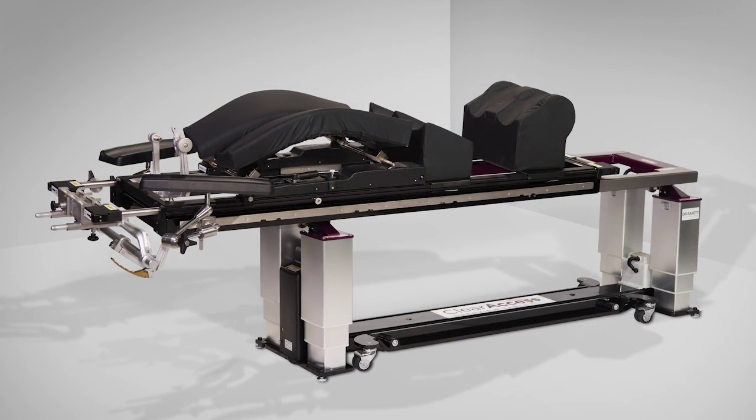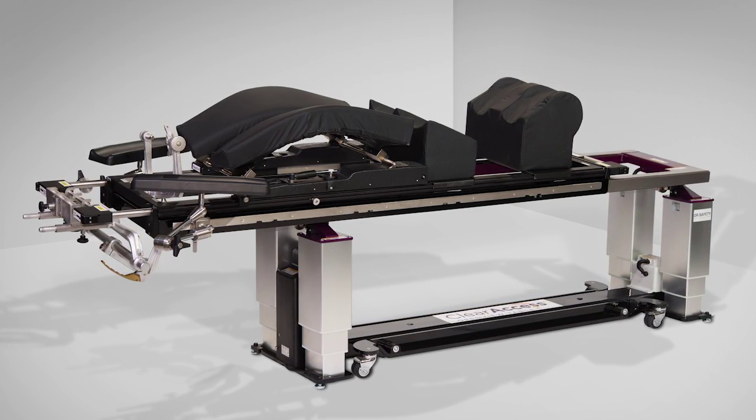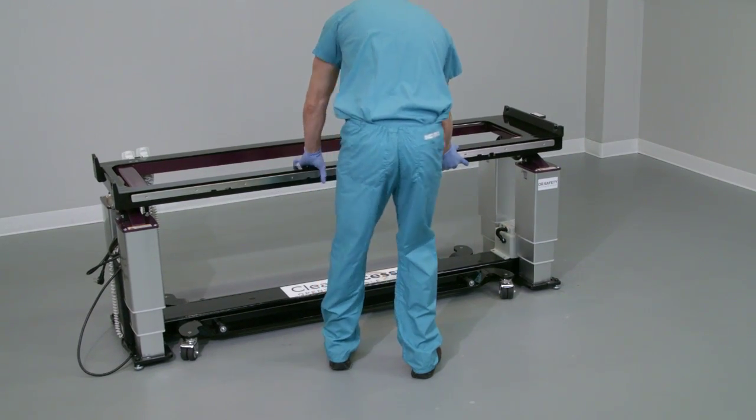Setup of the Clear Access table for these types of procedures can be completed in a few minutes. Let's review the correct setup of the Clear Access table with the FlexFrame, leg management, and cranial stabilization. Move the Clear Access table to the preferred location in the OR.